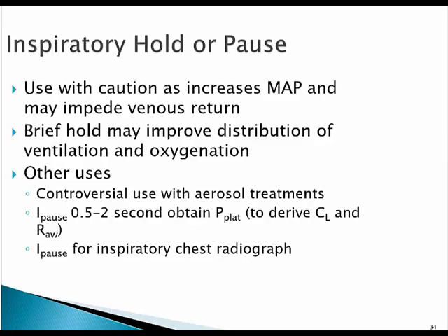As we continue our discussion on initiating and adjusting, we need to talk about the inspiratory hold or the inspiratory pause. This is something that we don't use routinely, simply because it has the potential to increase the mean airway pressure and lead to further damage or adverse effects. A brief hold may improve distribution of ventilation and oxygenation.